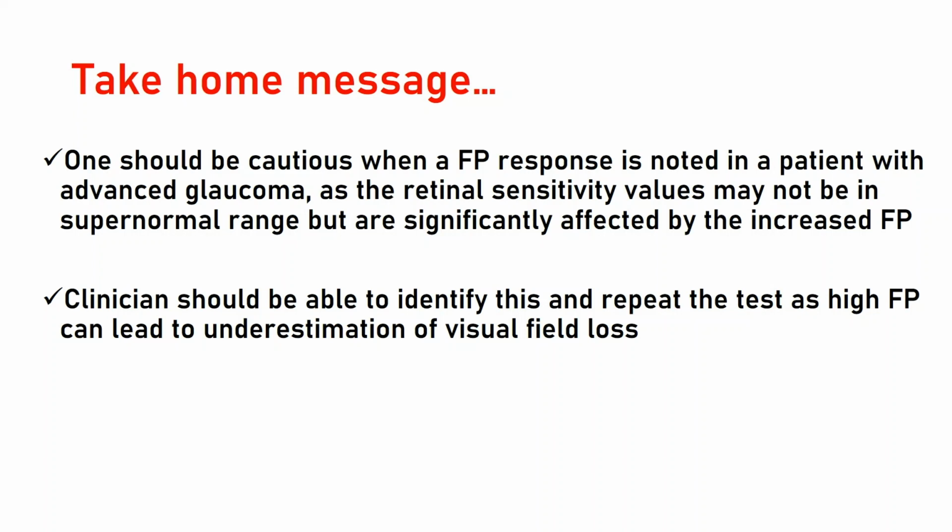One should be cautious when a false positive response is noted in a patient with advanced glaucoma, as the retinal sensitivity values may not be in the supernormal range but are significantly affected by the increased false positive. The clinician should be able to identify this and repeat the test, as high false positive can lead to underestimation of visual field loss.